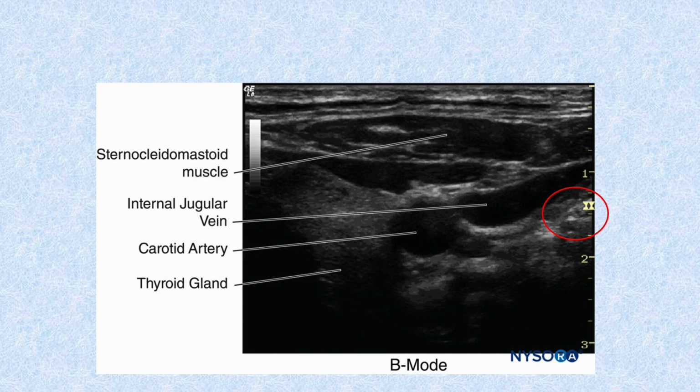Usually the focusing is represented by this line, this image here. All the ultrasound will have. So you can adjust the focusing. You can adjust this button here. There is a button for you to adjust to move this focus up or down. So if you want to see the image on the top better, you push your focus up, or you can adjust your focus down.